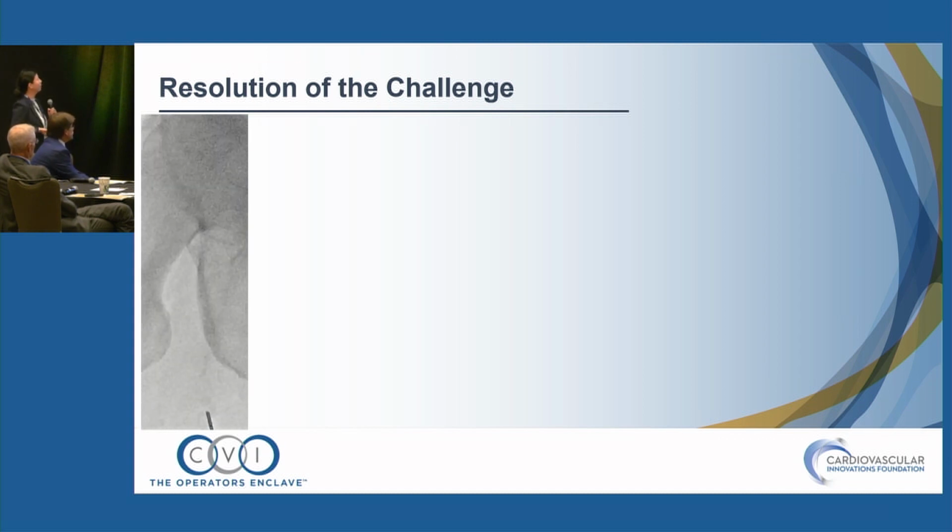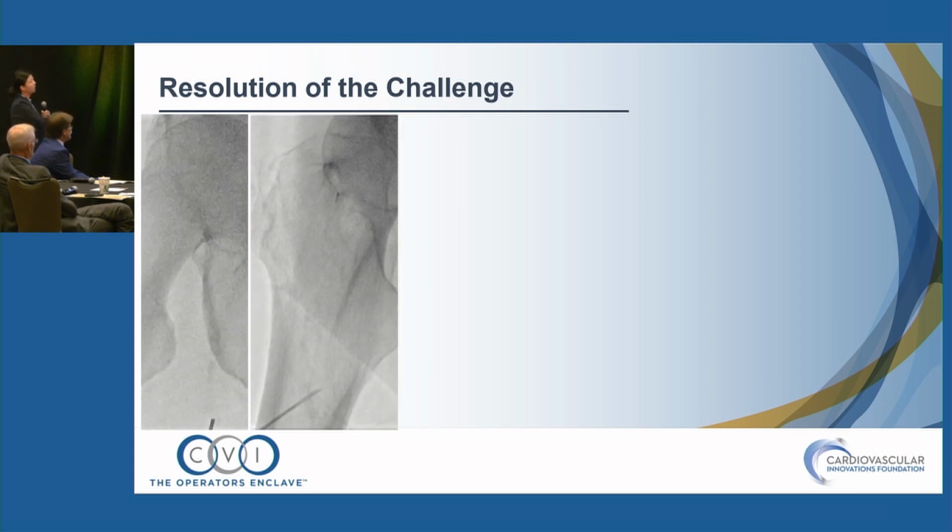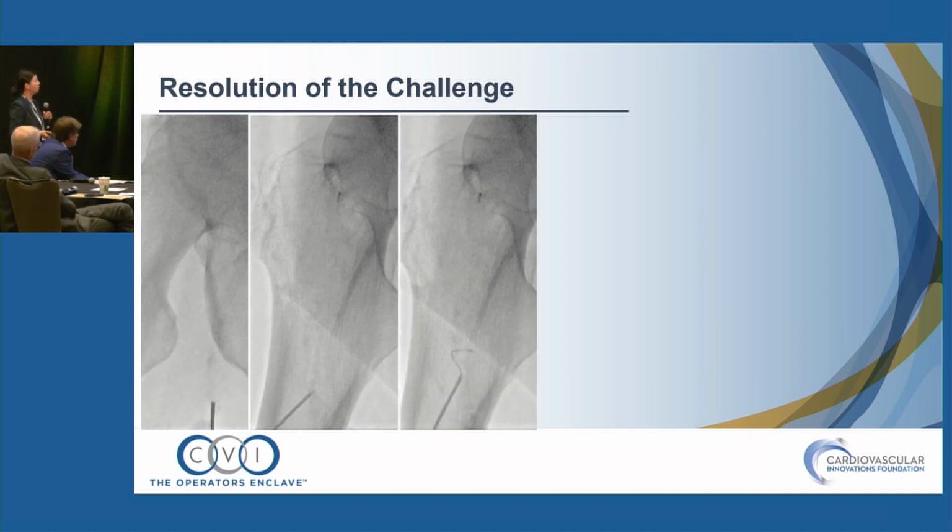Ultimately, at the end of like 4 hours, I said, the SFA is really rock hard. What I can do is stick the calcium, similar to how we stick the SFA stents, right? You can use the calcium as a landmark. So I stuck the calcium. We went oblique on our II, and I pulled the needle back, and I eventually was able to wire.